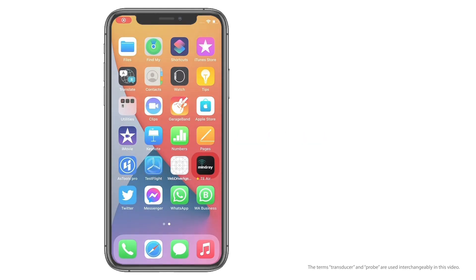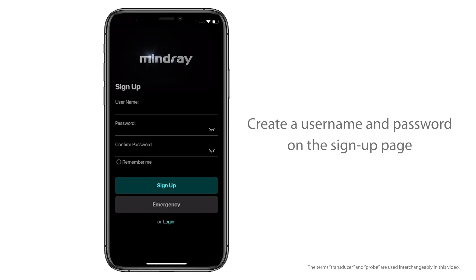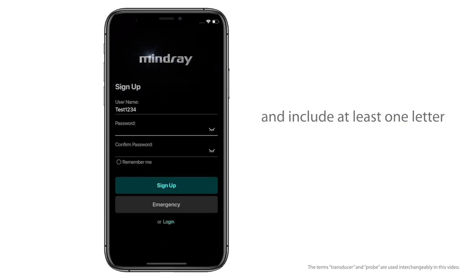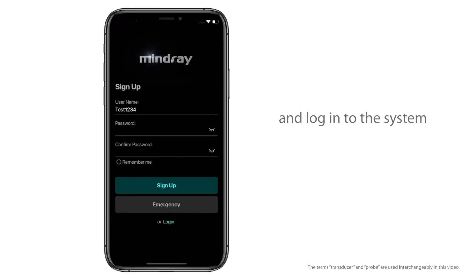Signing up for an account: Open the app and press Sign up for a new account. Create a username and password on the signup page. The length should be between 8 and 16 characters and include at least one letter. The password can only be letters and numbers. Press Sign up to create a new account and log in to the system.